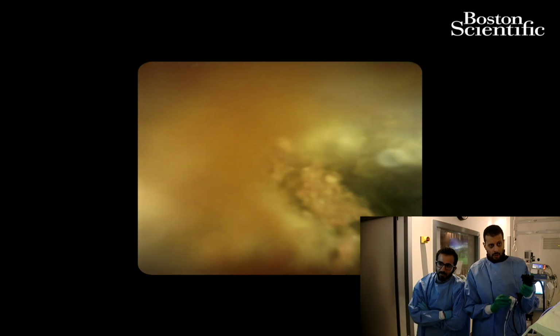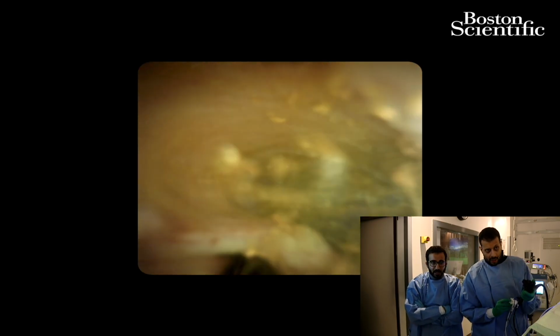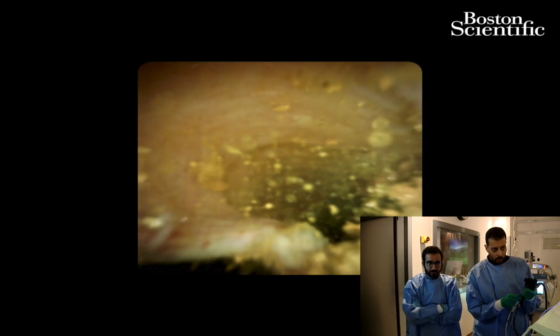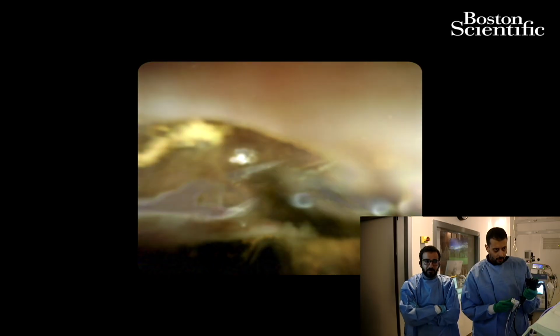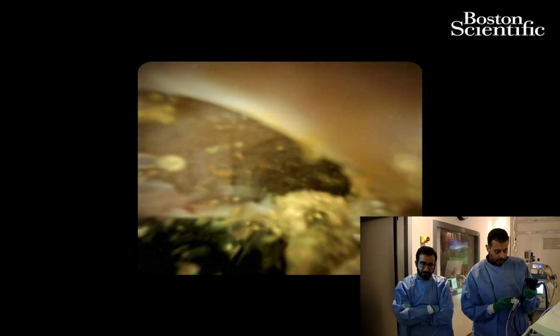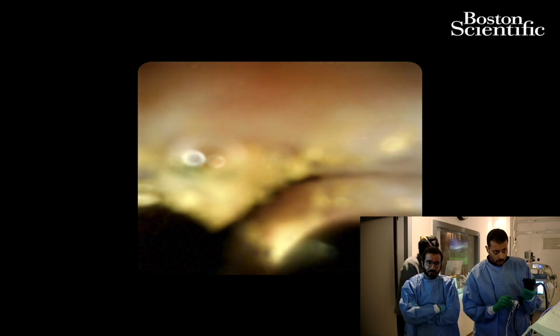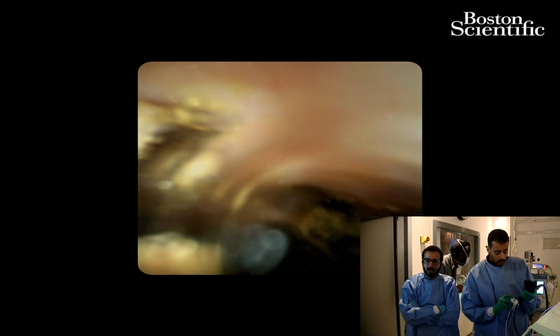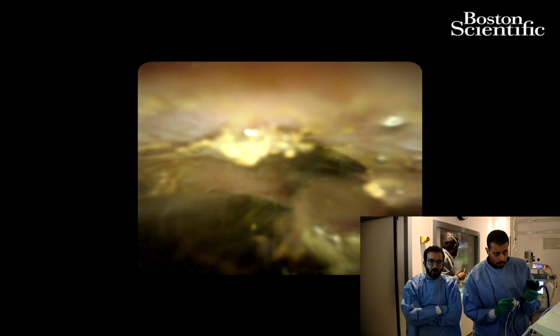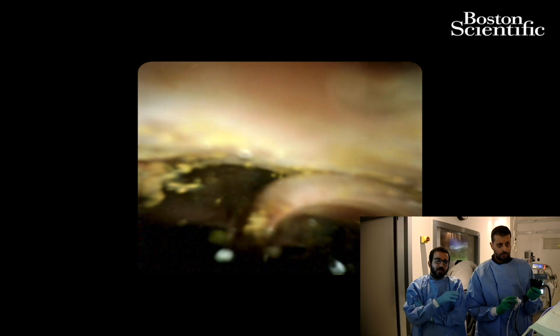So here, this is a cystic duct. Yes, Ammar. We have 2 more minutes to stay with you, so yeah, you can. So that's the cystic duct here. We're withdrawing. The CBD was examined very well. All the stones that remain are fragmented and floating. So I think that's a pretty good result. So I think we finished with the main part. If there's any question, we're happy to answer.